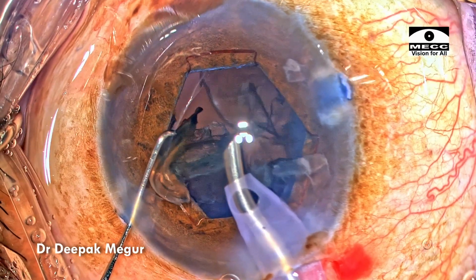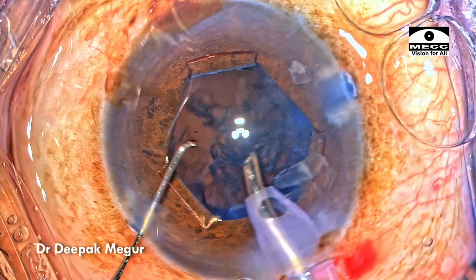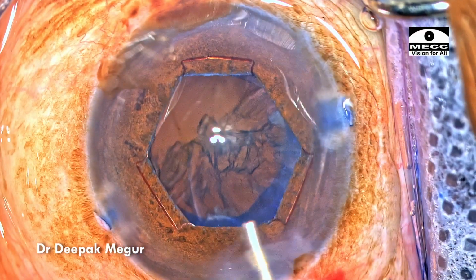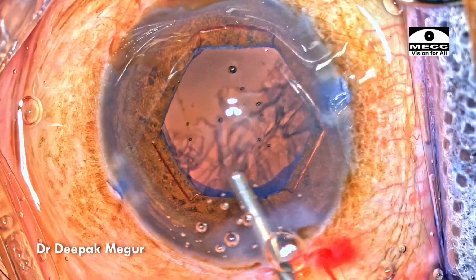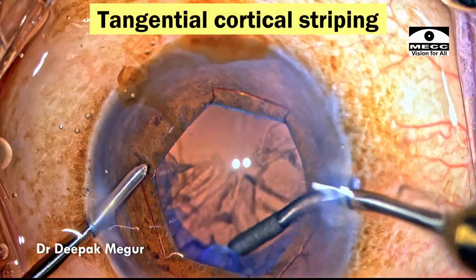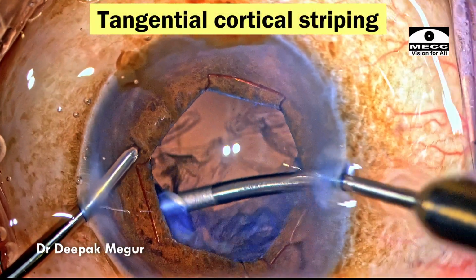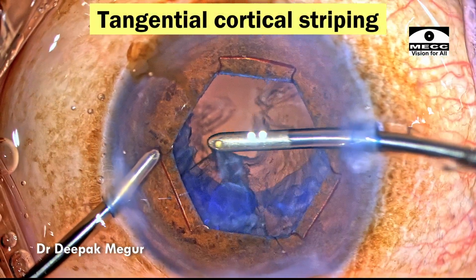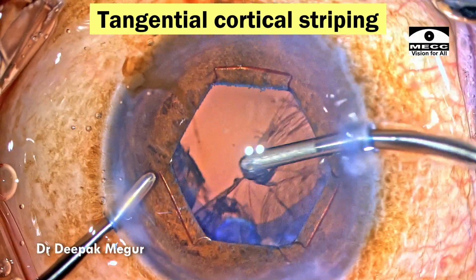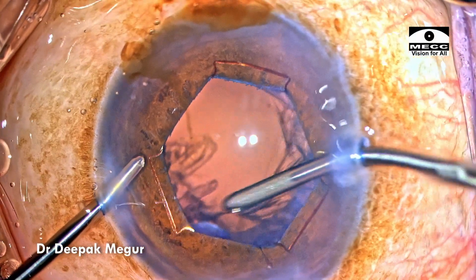The last few fragments are emulsified and it's time to remove the cortex now. Removing the cortex in such a loose bag is probably the most difficult thing to do in this case. I'm going to use the tangential way of stripping the cortex, and I want to be as gentle as possible. But the moment we engage the cortex, the entire bag moves in.